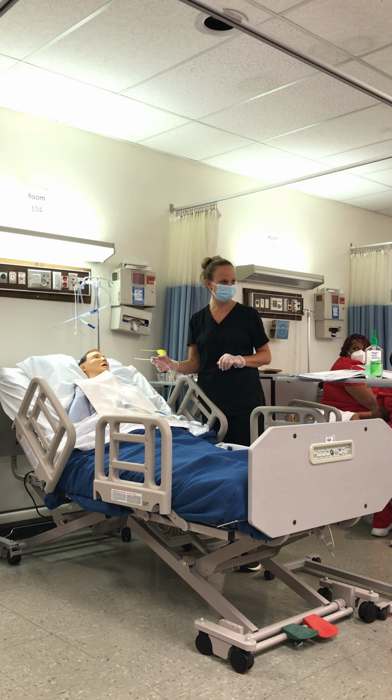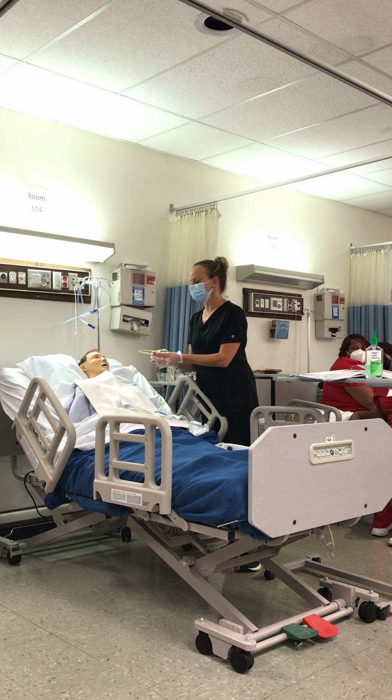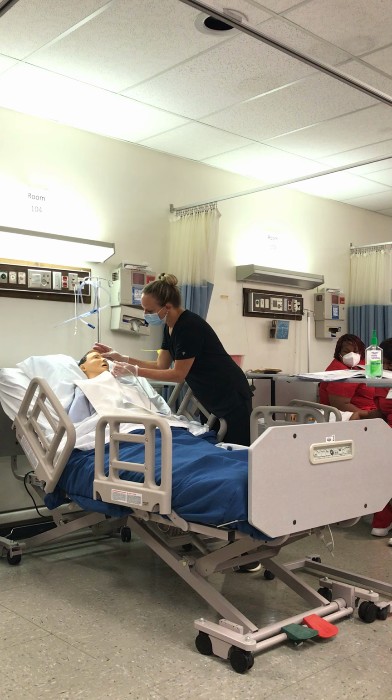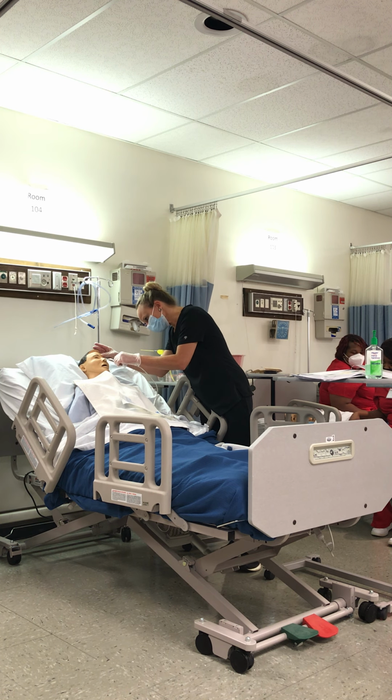Okay, so we're in our semi-Fowler's. What else? They can tilt that neck back a little bit. And then, okay, I'm going to start inserting this tube. Remember, if you have any kind of shortness of breath, or if you start to feel like you need to cough, let me know, okay?